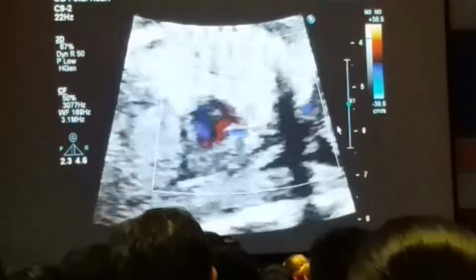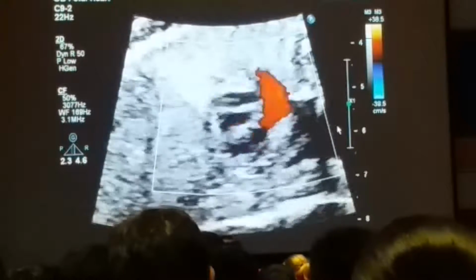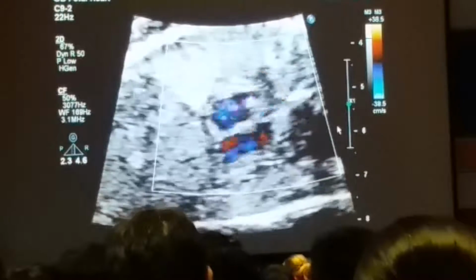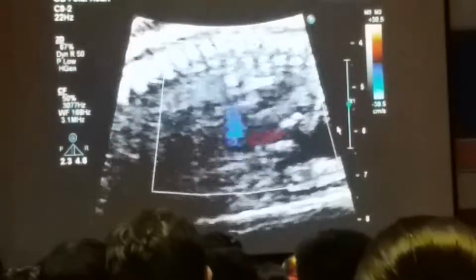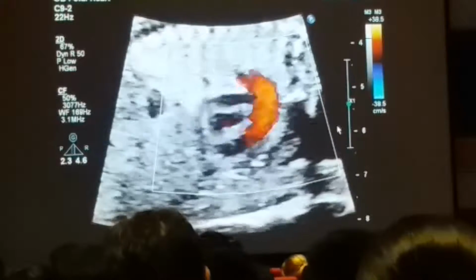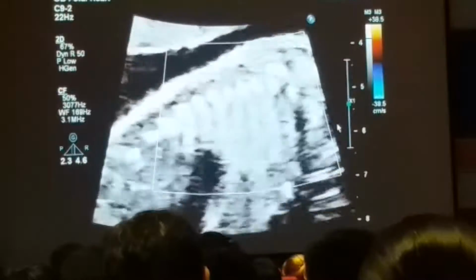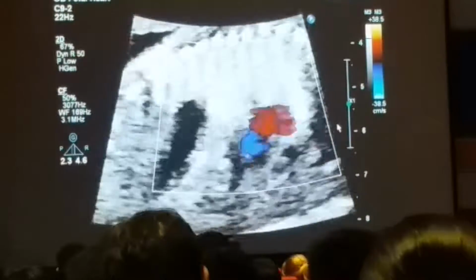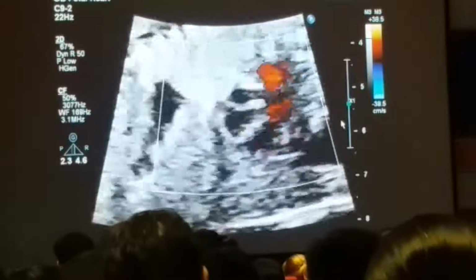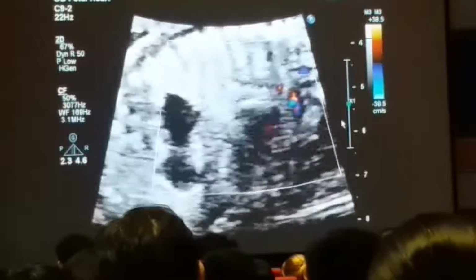Pardon? What did you say? They say the ductal arch. Someone say ductal arch. I think that is the ductal arch, not the aortic arch. So that looks like certainly like the pulmonary artery, but now that you've seen the one vessel, you have to see the other.